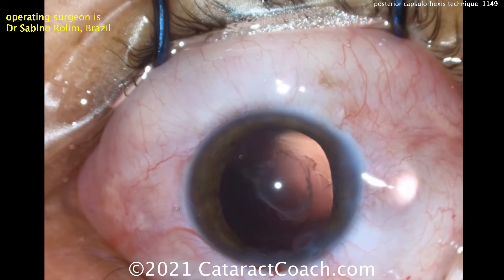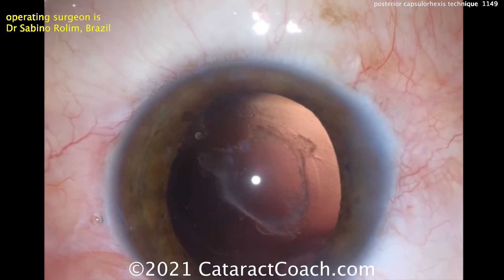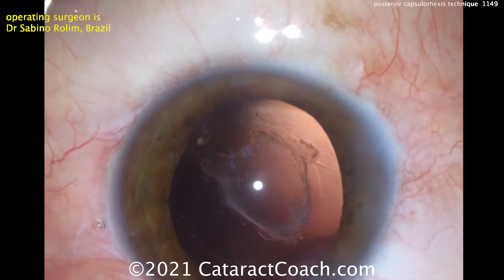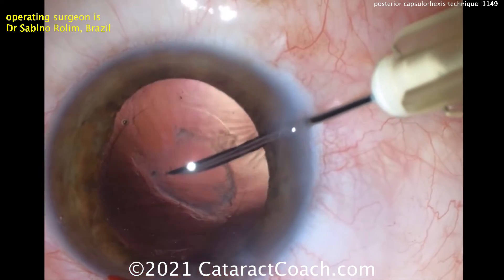At the end of the case, the capsular bag is empty and there's a lot of scarring on that posterior capsule. You could just put the IOL in the eye and let it heal up for a month or two and then do a YAG laser capsulotomy, but let's show you this instead.